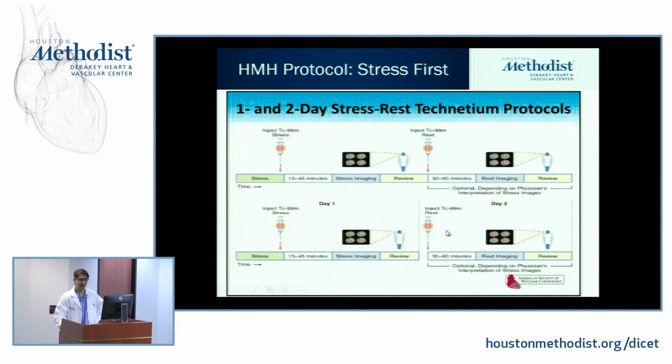And this is just a graph showing us the actual imaging protocols that we use in our lab, which is stress first, either 1 day or 2 day protocols, but pretty much going over exactly what I discussed in the last 3 slides. Why do we do stress first?